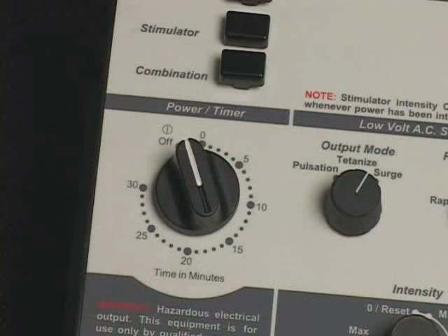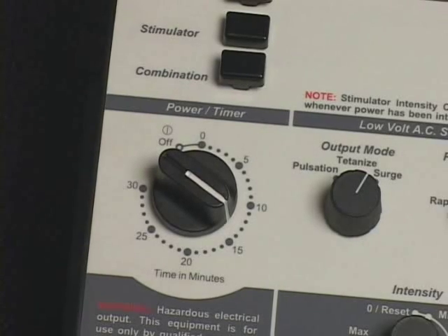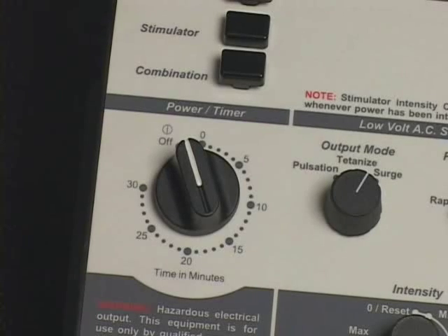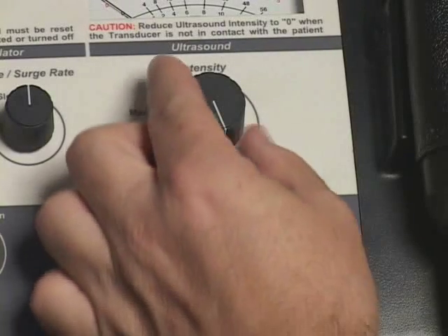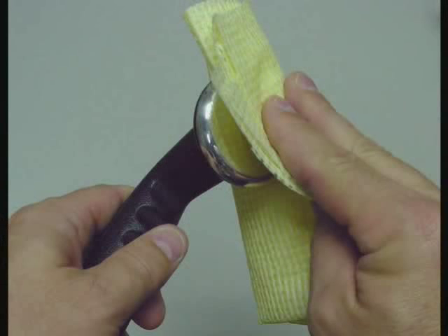The AC power will shut off and a bell will sound when treatment is completed. To initiate early shutoff, rotate the power timer knob counterclockwise to the off position; the AC power will shut off and a bell will sound. Reduce the ultrasound intensity control to the zero position and thoroughly clean the transducer faceplate before placing the transducer in the transducer cradle.